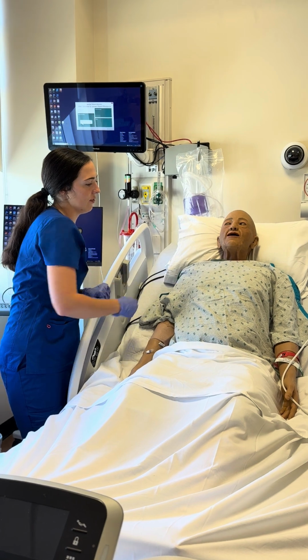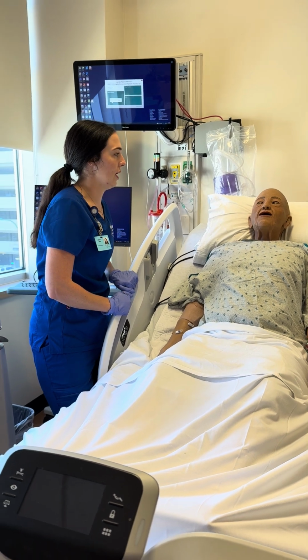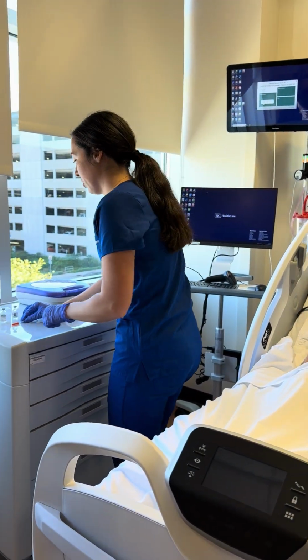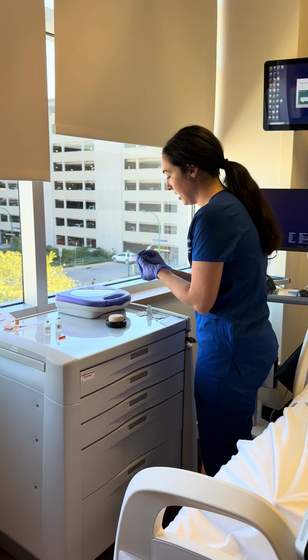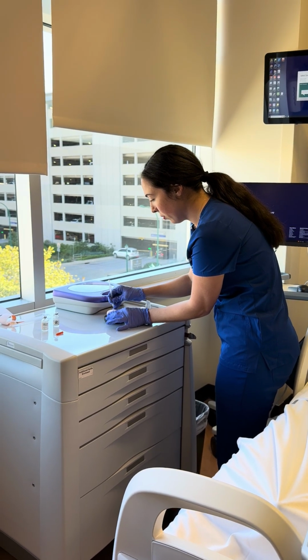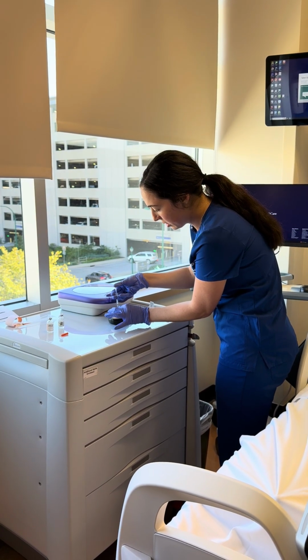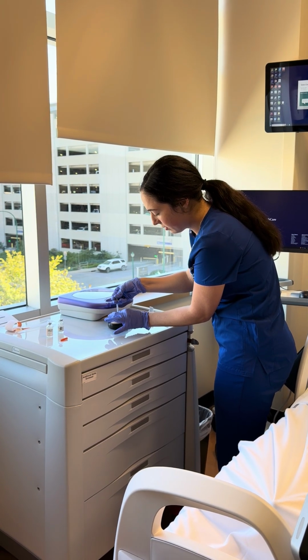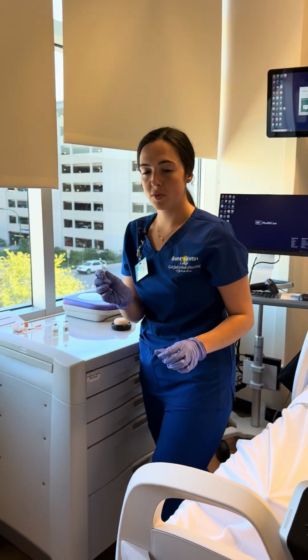And that is everything. So can you verify your name and date of birth for me again? Ivy Armstrong, 3/9/1964. Okay, perfect. So we're going to go ahead and get it. Would you like me to count down for you? Sure. Okay. All right, so I'm going to go ahead and uncap the needle. The area is clean, so I do not want to touch that. I'm going to grab it like a dart here, and I'm going to administer this slowly. So I'm going to pinch the area just a little bit, go in at a 90 degree angle, then grab the needle. I'm going to administer it slowly. Okay, engage my safety. I'm going to go ahead and put this in the sharps bin over here.